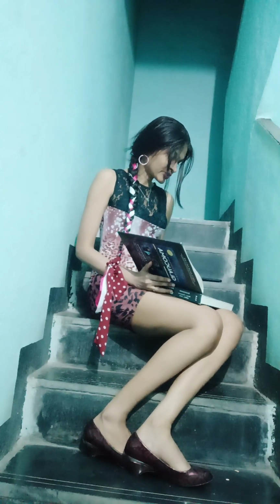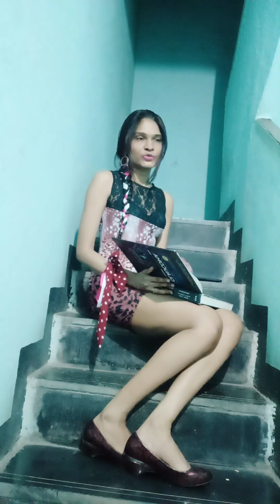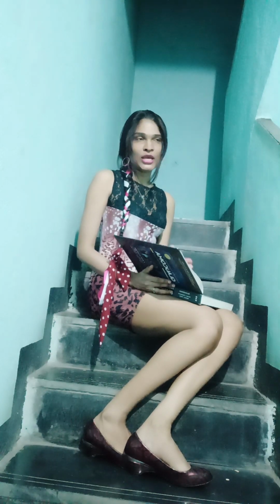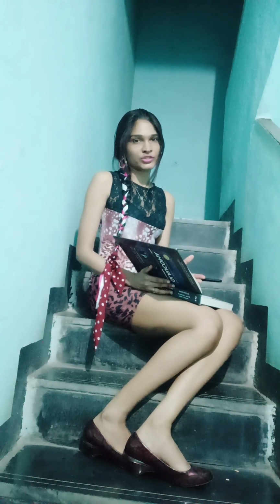Technique of indirect gonioscopy. The cornea is anesthetized. Before doing any procedure in medical or surgical practice, okay, we have to explain the need of the procedure and how it is done, and we have to take the verbal or written consent depending upon the procedure, okay.